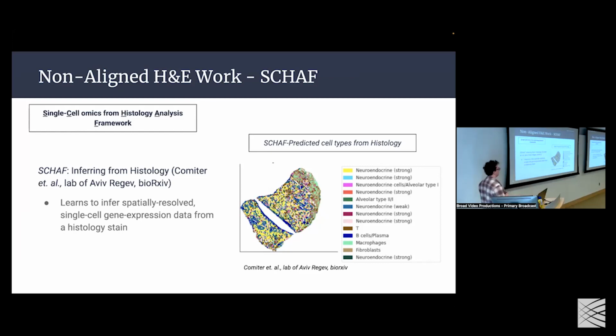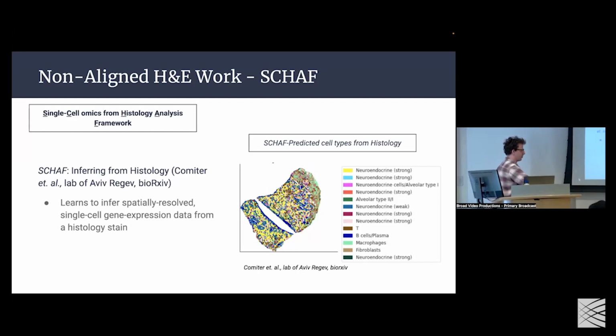So what I mean by high throughput is, for those that are not familiar, if we have a tissue and we want to perform an assay that gets you spatially resolved transcriptomic information, there are methods like MERFISH, StarMap, very exciting, popular technology. A lot of the time, because it's incredibly expensive, you will only be able to get maybe 900 to 1,000 genes, much lower throughput than single cell RNA sequencing. So one of the cool things about this method is that we do still get 20,000 genes worth of information for each cell.